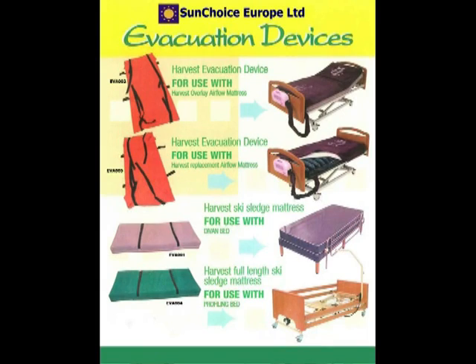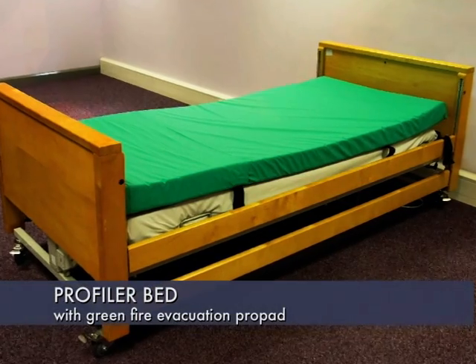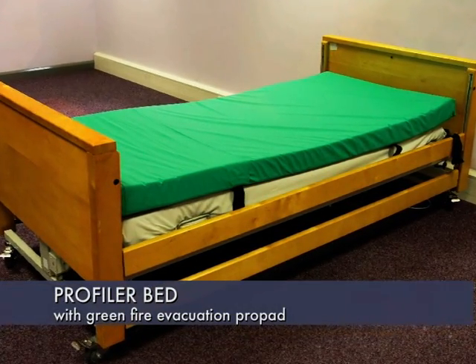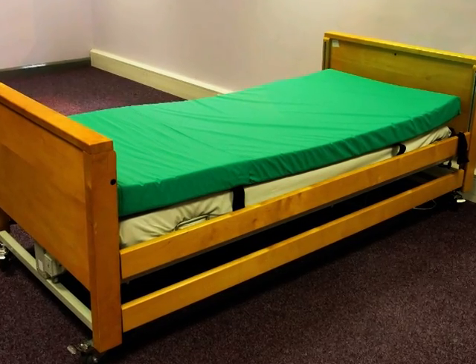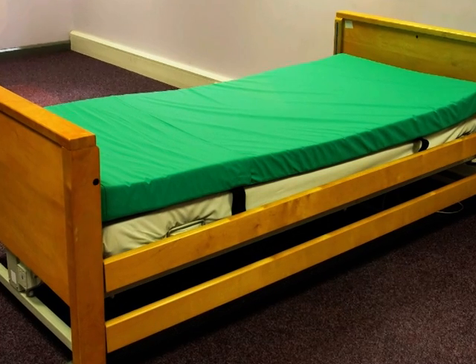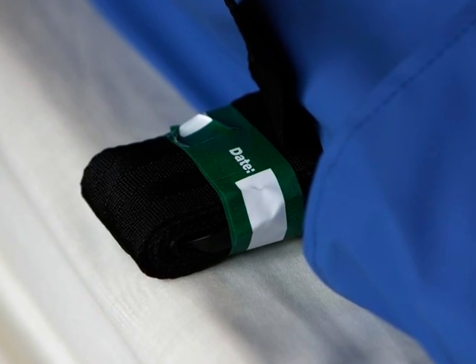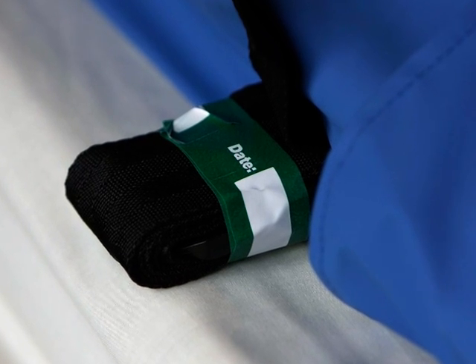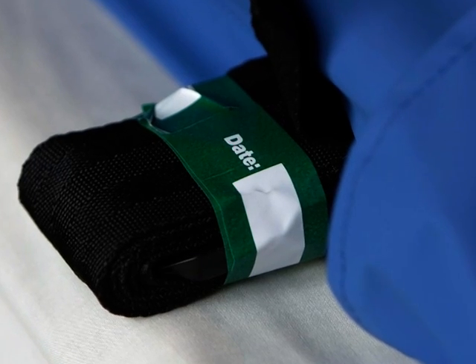We will now show the equipment in situ. Bedroom 1 has a profiler bed with a green fire evacuation ProPad. This device is fitted as follows. The 2 end flaps fit under the bottom mattress, which help to secure its position on the bed. Please note that the labelled strap seals should be checked weekly to ensure that they have not been compromised. These should have been signed and dated.